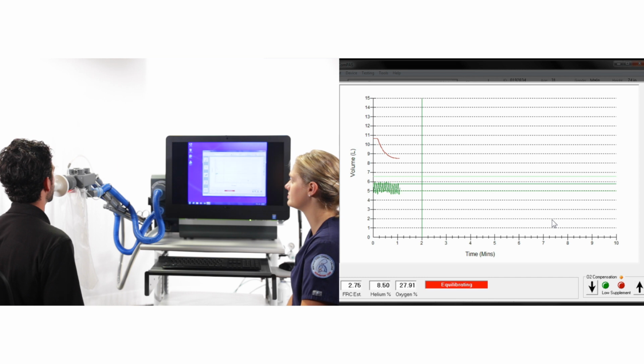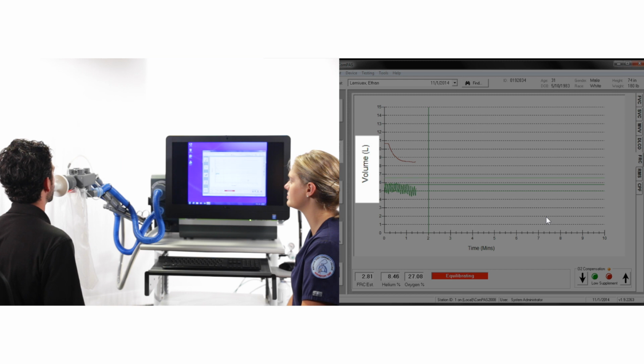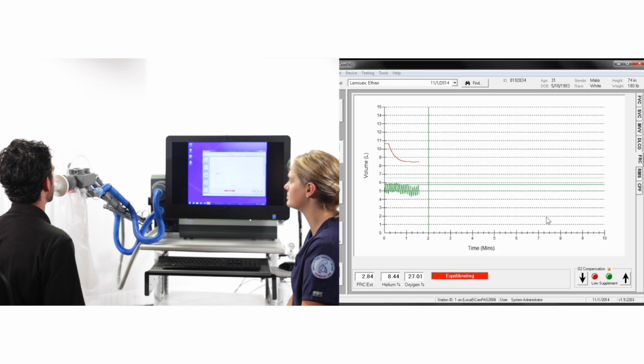The SpiroAir automatically replaces the oxygen used by the patient to maintain a stable tidal volume position. The runtime screen is always looking at the end tidal point of breathing in relation to FRC baseline, the starting position on the spirometer. As the test progresses, the runtime screen will display the tidal volume, helium equilibration, and also give the user an estimate of FRC as it begins to stabilize.